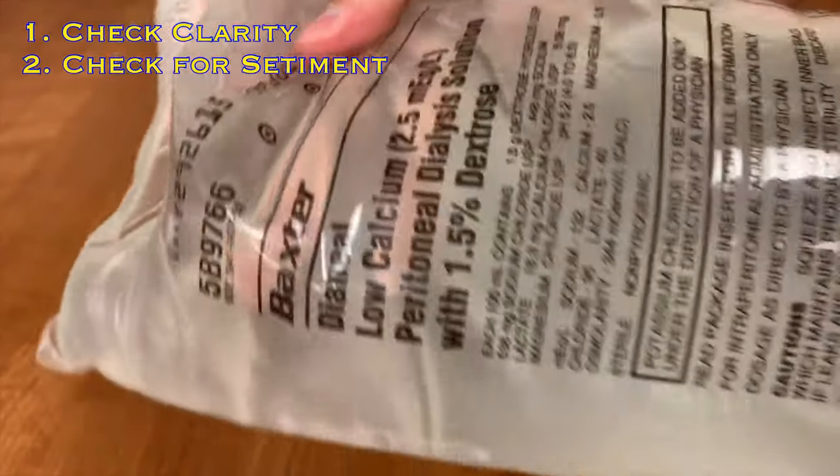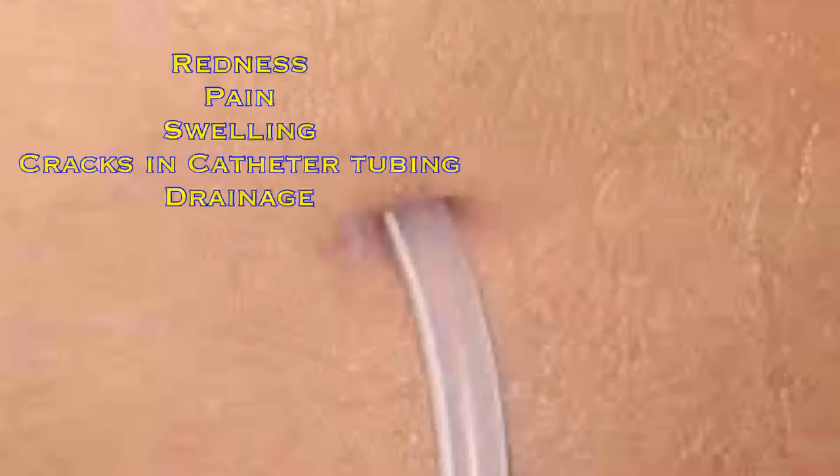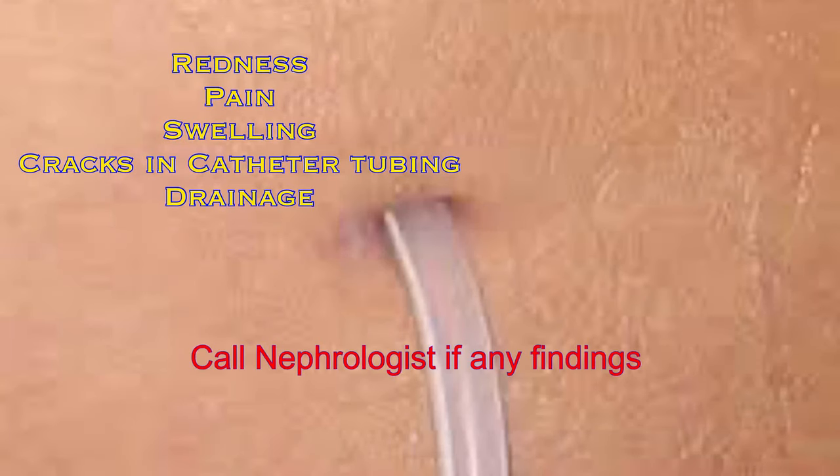Next, look for any sediment floating in the bag — you should not see any. Finally, we'll need to inspect the catheter site, looking for redness, pain, swelling, cracks in the catheter tubing, or any drainage. If you notice any of these, call a nephrologist prior to performing dialysis.